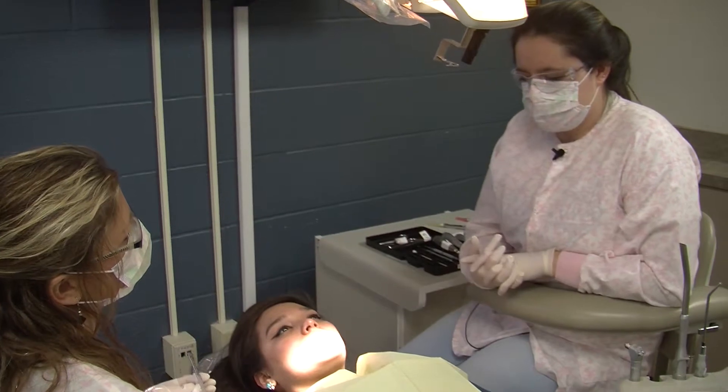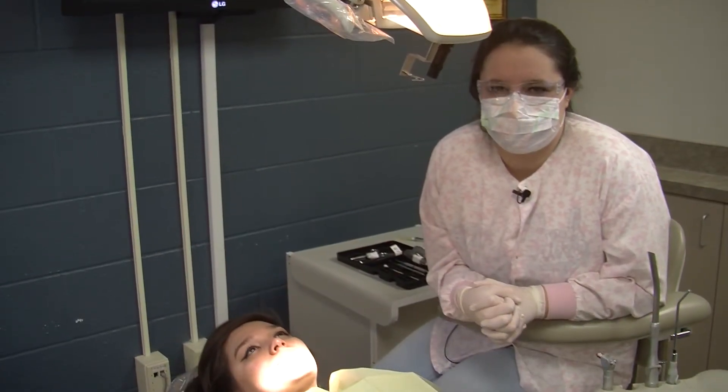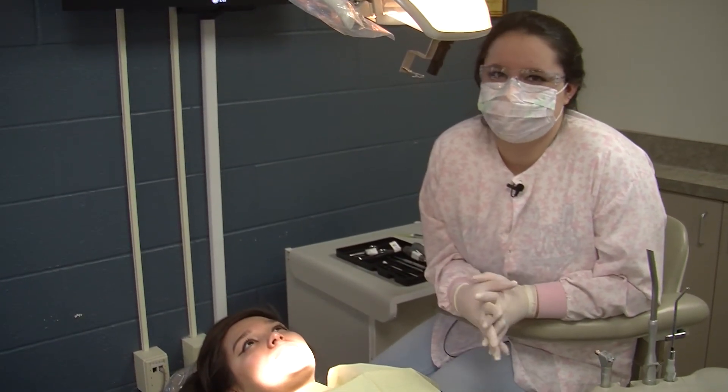Then we tell the patient no smoking, no drinking out of a straw, or spitting for 24 to 48 hours. Those are the steps to a simple extraction and you're catching it in the classroom.